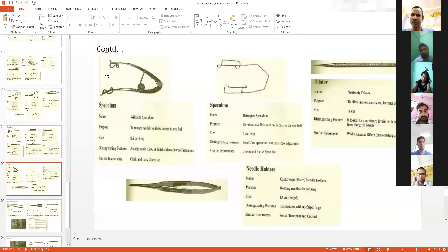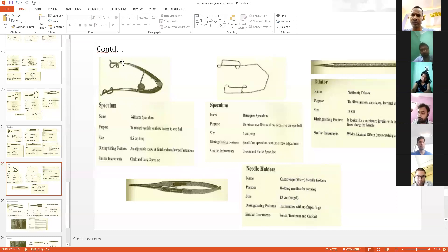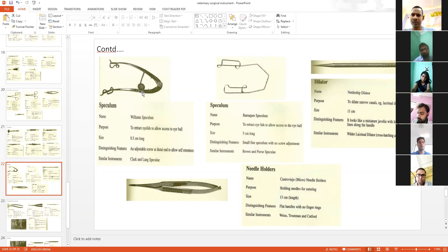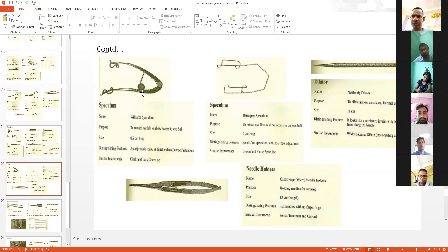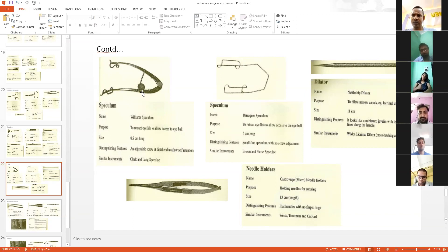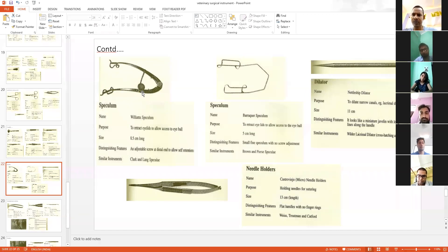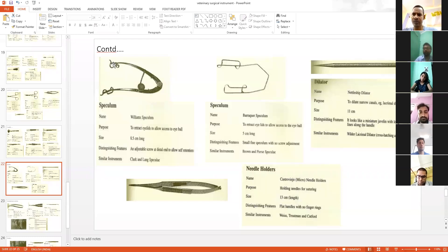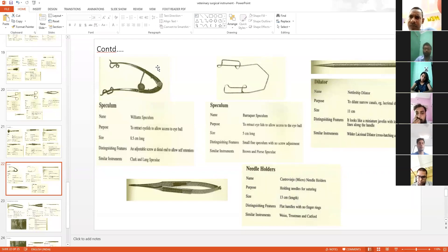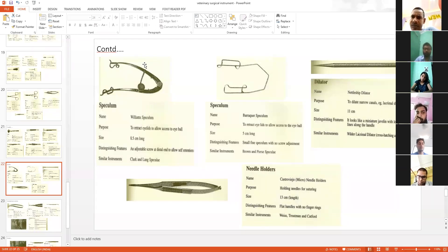This is a speculum used to retract eyelids to allow access to the eyeball. If you want to see the eyeball completely, it's not possible because eyelids will cover the whole eyeball. So this speculum helps with that. Try to remember the name and use of this instrument.